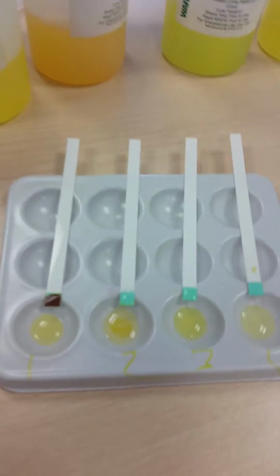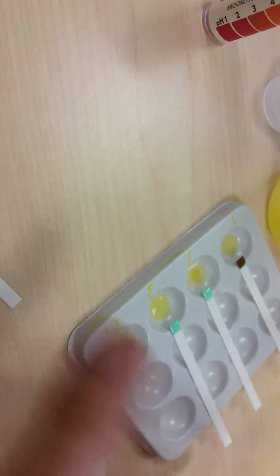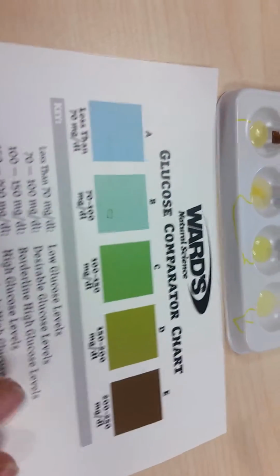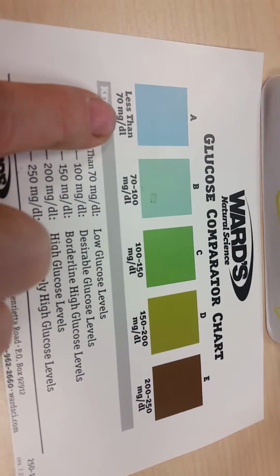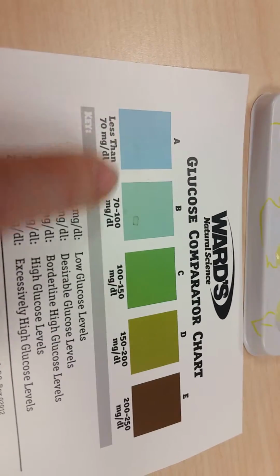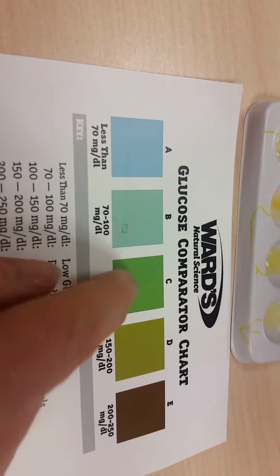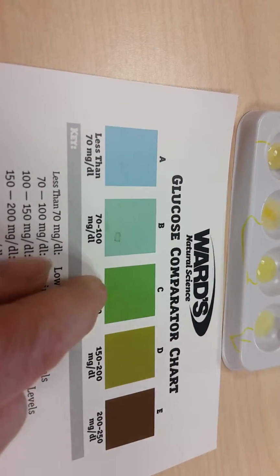So this is the glucose test, and once again you can see we're looking for color changes, and you can actually compare those colors onto this chart. And anything A is definitely normal, that's very low glucose. This is a desirable amount of glucose in your blood, and this is borderline. This would be somebody maybe who has that pre-diabetes.